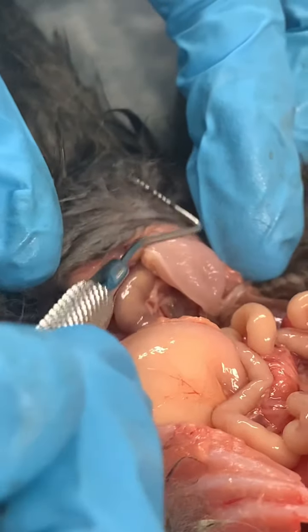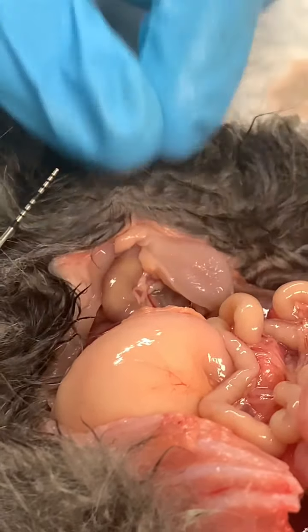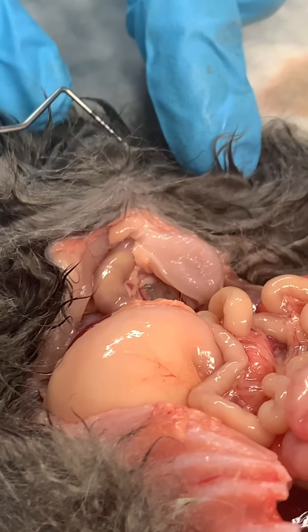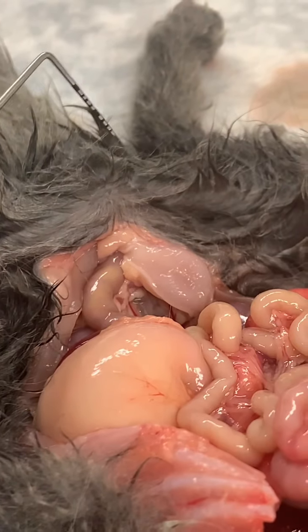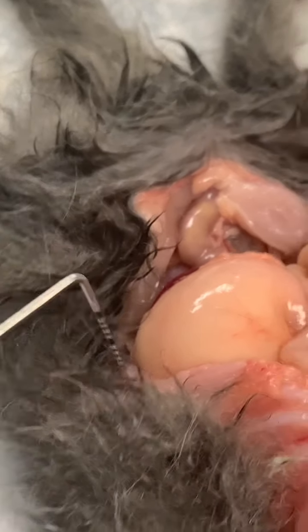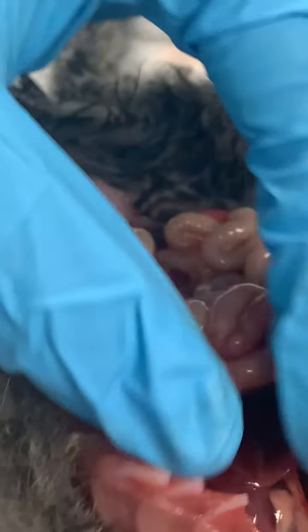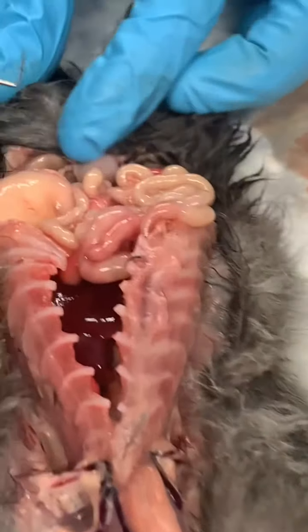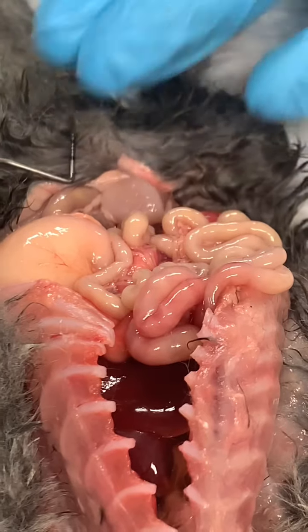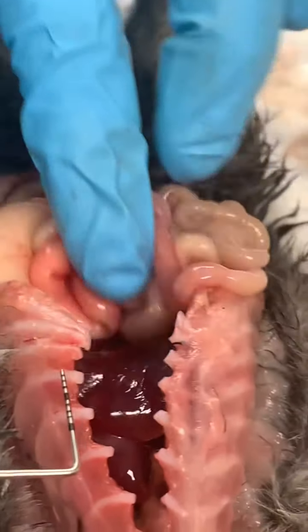And then we obviously have the prepuce, which is kind of hard to decipher, but our prepuce and our testes back here. Our penis, since this is such a small kitten, it may be hard to expose, but it is going to sit in the prepuce or the sheath.